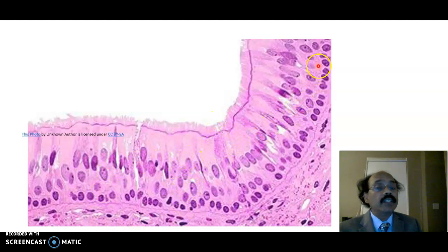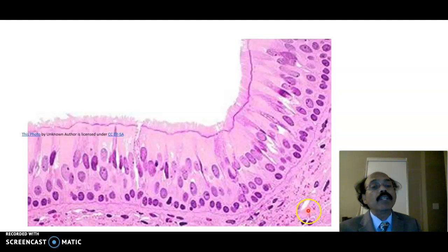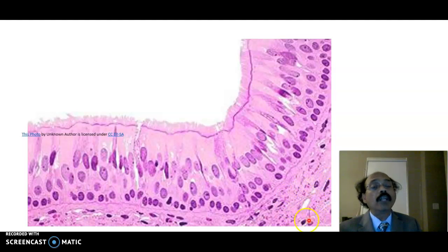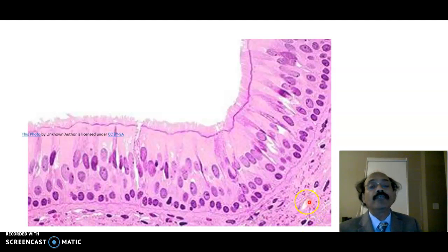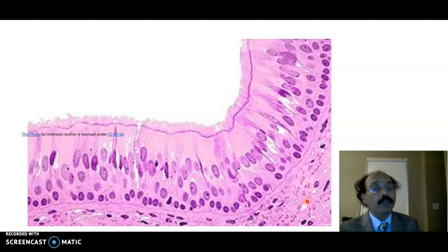Underneath the pseudostratified ciliated columnar epithelium, this is the lamina propria — a loose areolar connective tissue. It is very vascular and contains blood vessels and lymphocytes. It may also contain some mucous-serous glands, but mucous and serous glands are mostly found in the submucosa.